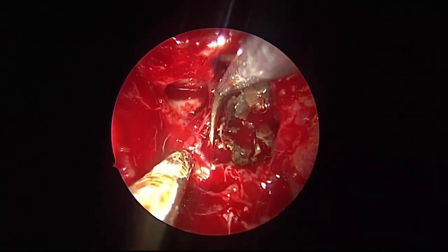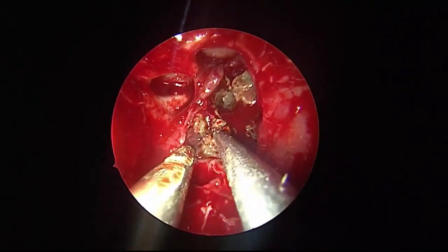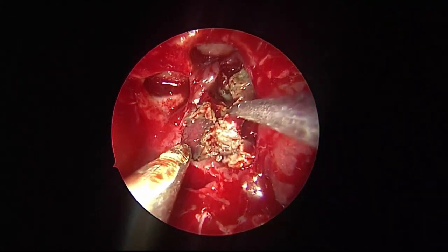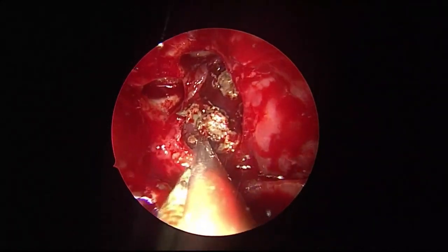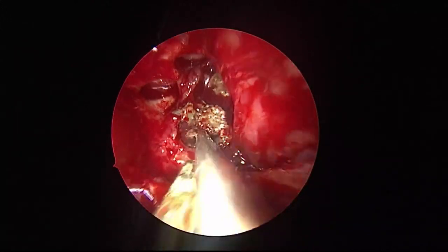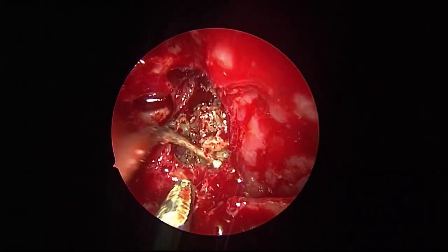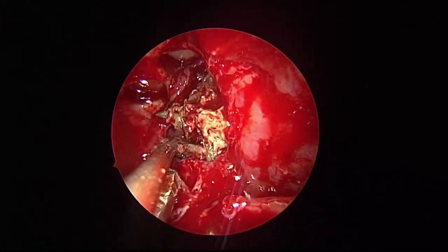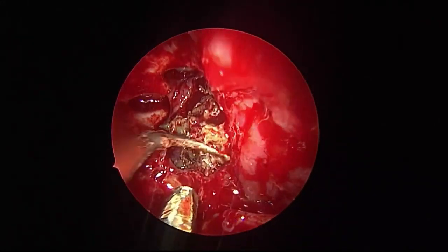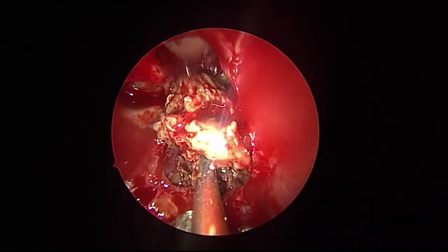Engage the fungus with a ball probe and dislodge. See this? See with the ball probe. It's a gentle traction movement to dislodge.